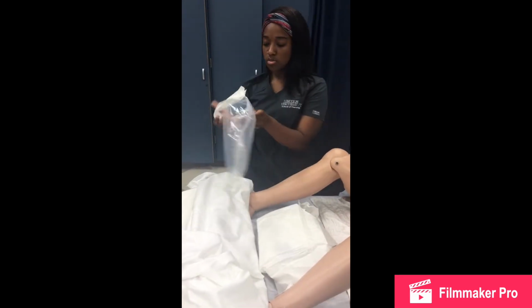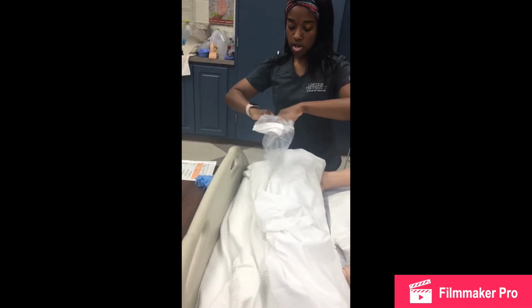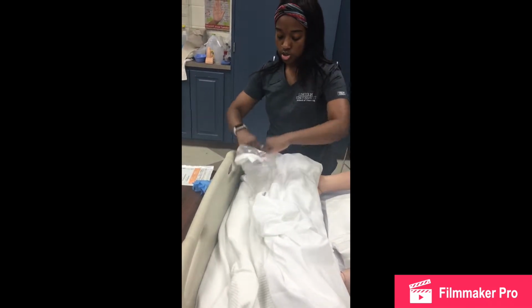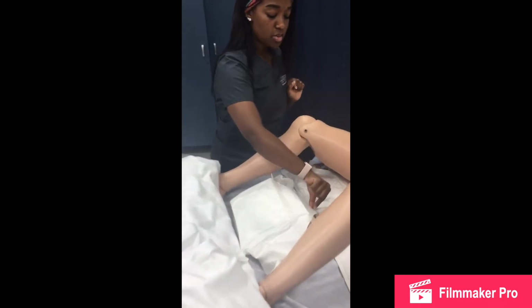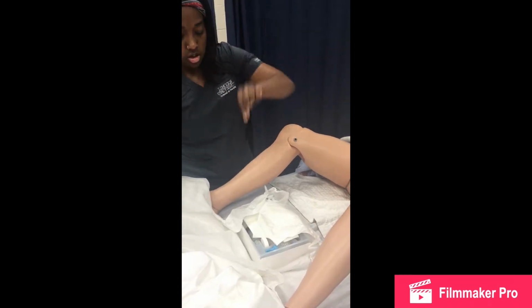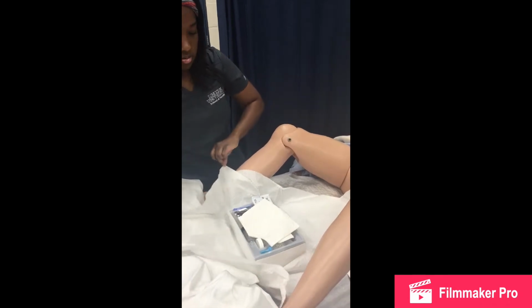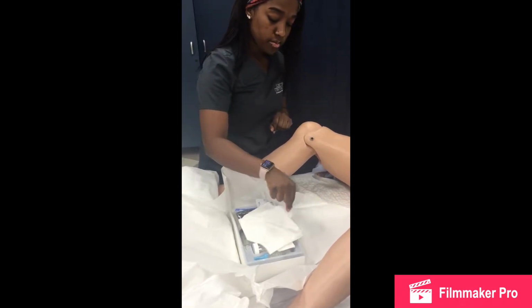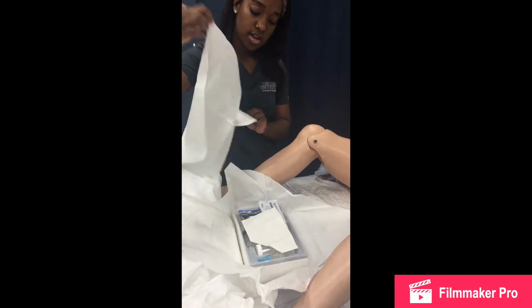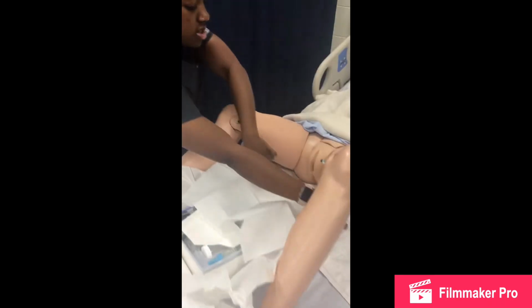Okay, I'm going to take my trash bag, and that'll be used for all of my trash for the bed. This is not sterile, so I'm going to be able to touch the edges and open it up, making sure they don't flap back. Then I'm going to take my waterproof drape, shiny side down. I'm going to be very careful. I'm going to stick it underneath my patient.